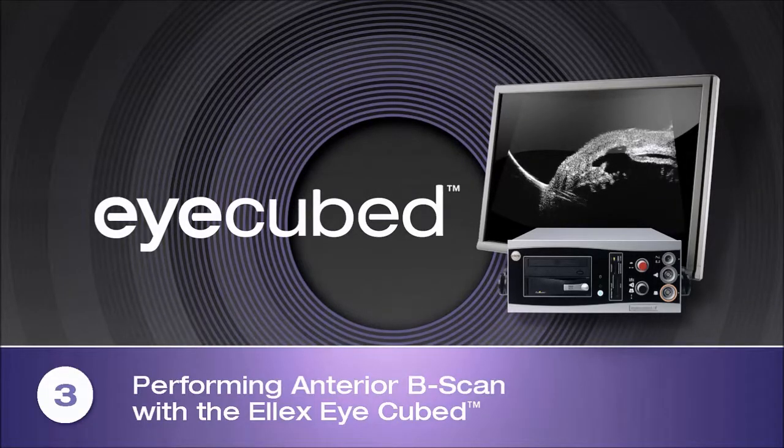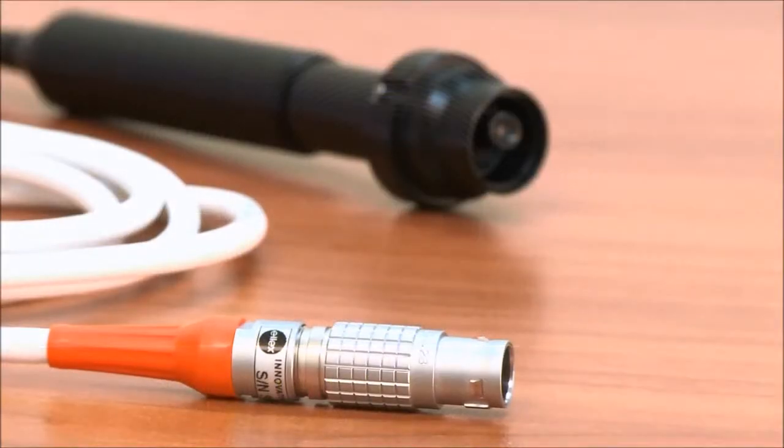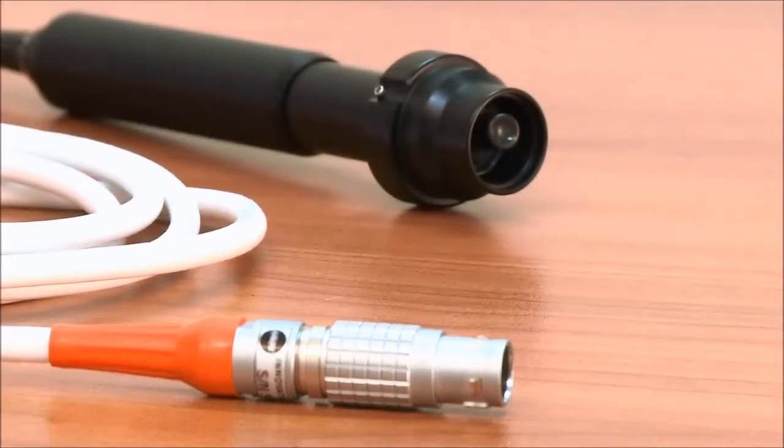Performing Anterior B-Scan with the LX iCubed. Performing high-resolution 40 MHz B-scan of the anterior segment with the LX iCubed is easy, fast and accurate.